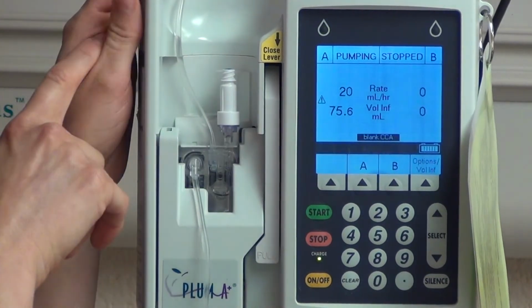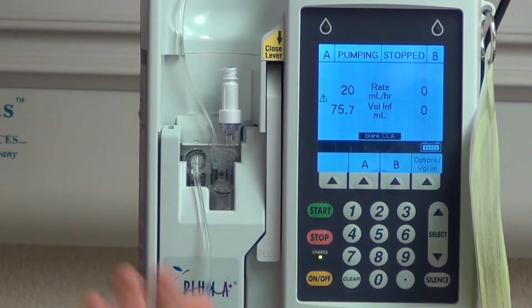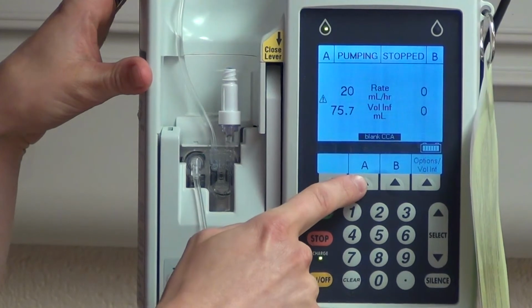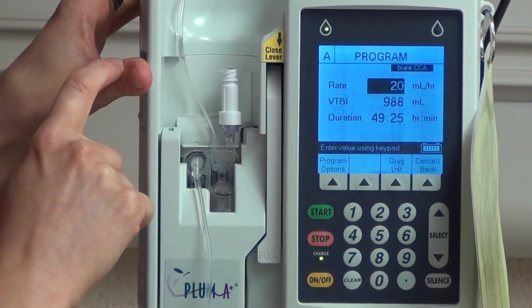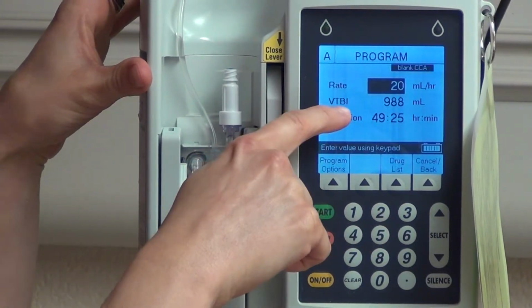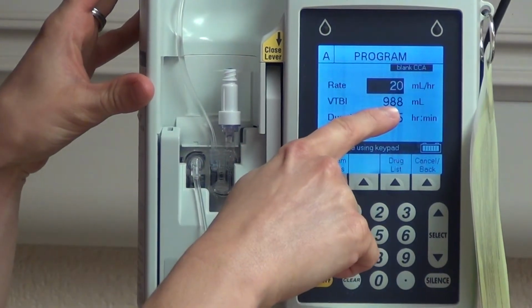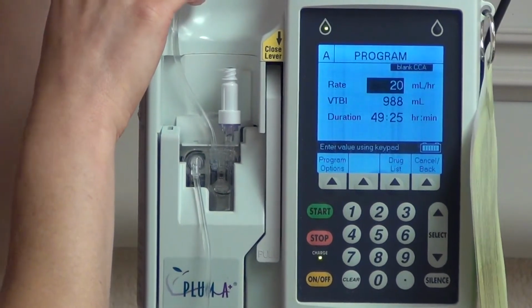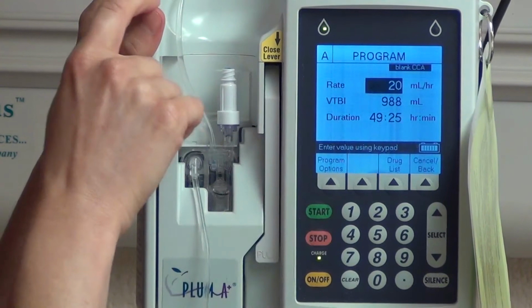Right now it's set at 20, and let's say that you have an order to increase your patient's rate to 150 mLs an hour. So we'll show you that. If you click the letter A for your primary rate, A takes you here. You have rate set as 20. VTBI stands for volume to be infused, and that is how much you want to give the patient, and that would be like your whole bag of 1,000 mLs. And so right now it's set for 988.